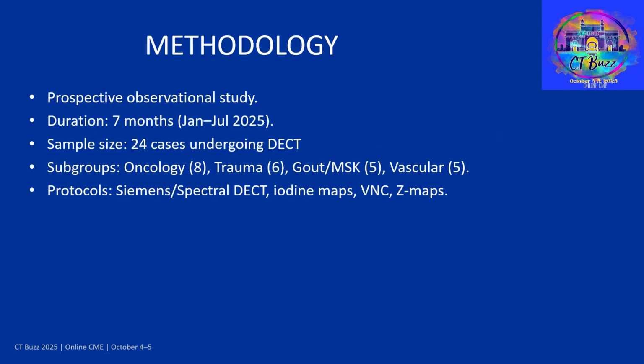Methodology. This was a prospective observational study conducted over 7 months with 24 cases divided into oncology, trauma, MSK, and vascular subgroups. We used Siemens dual energy CT protocols including iodine maps, virtual non-contrast, and Z maps.